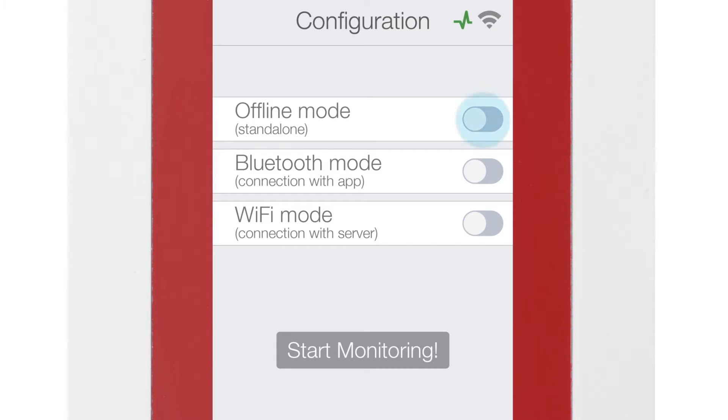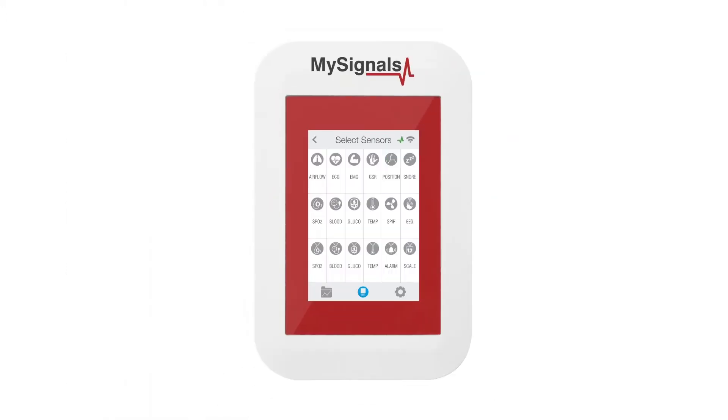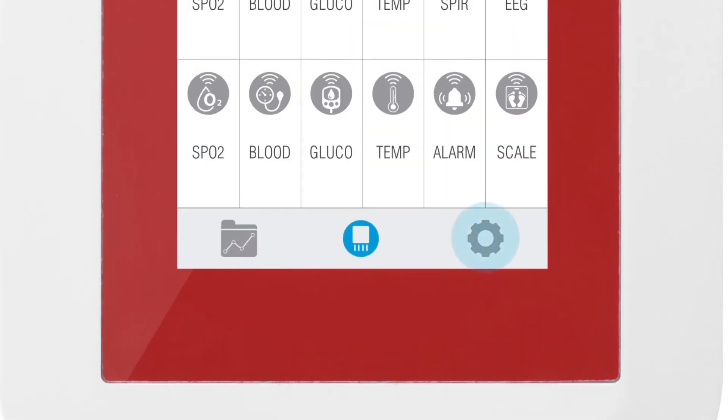Select Offline mode and click on the Start Monitoring button. Then click on the Settings button.